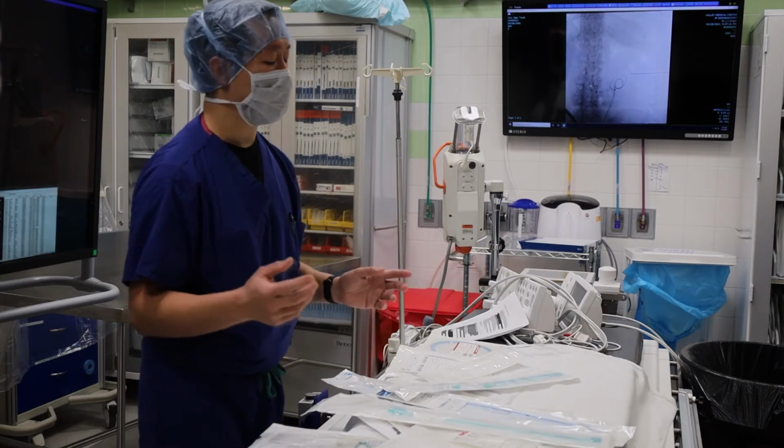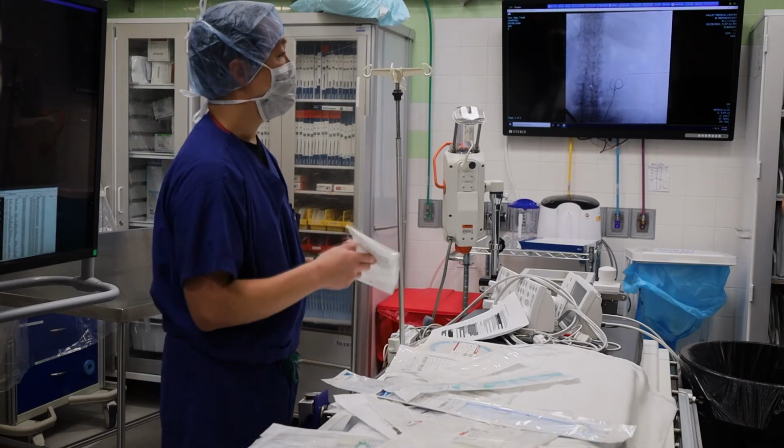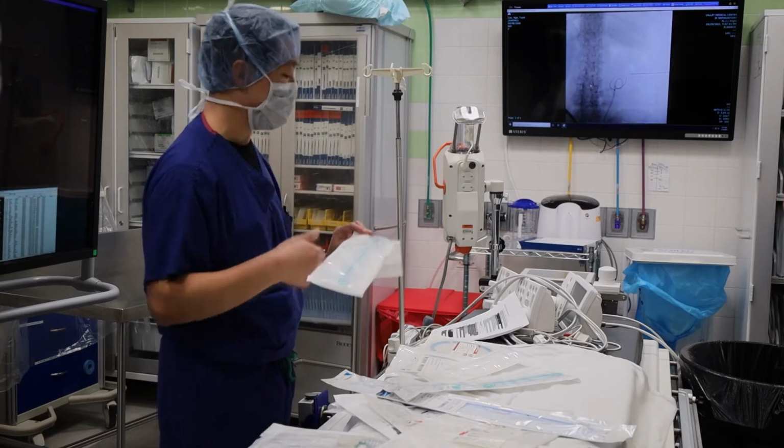The kidney's already unhappy. We stirred it up. Okay, and now pus is coming out. We collect the sample of pus. Oftentimes we give it to the nurse up there, and we send it for sampling.